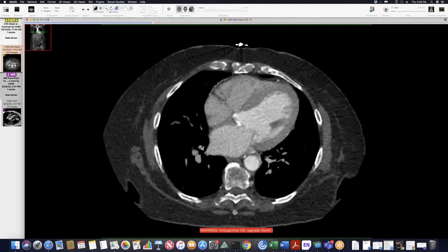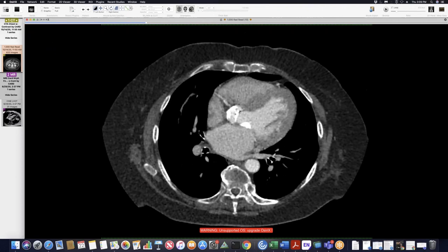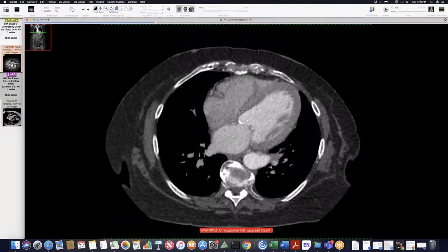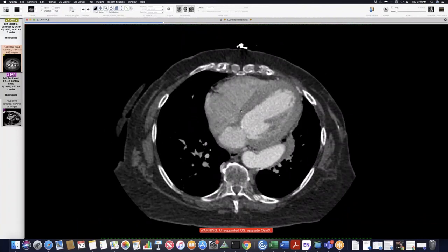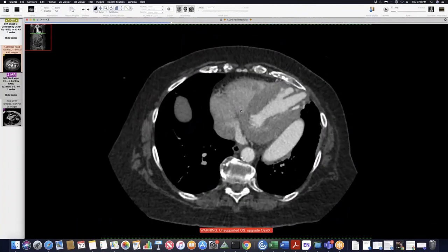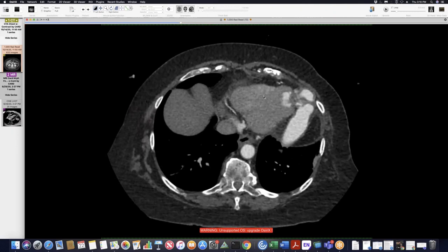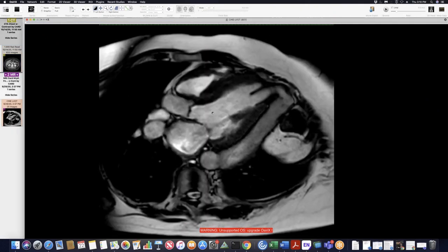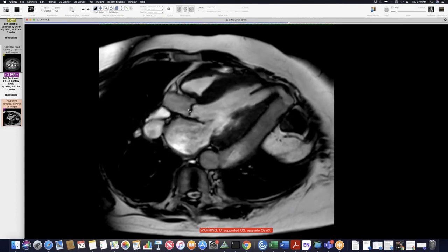So of course, when this patient presented with severe aortic stenosis and very symptomatic, he did okay for 2 years, and now he's coming back with really bad shortness of breath. And they were wondering if this was obstructed. This doesn't really look like it's obstructed. And here's just an MR image of it. I just included the three chamber. You can see how bad the aortic stenosis is here, but the valve is not really even opening. And then you can see the flow through here, through this little valve.